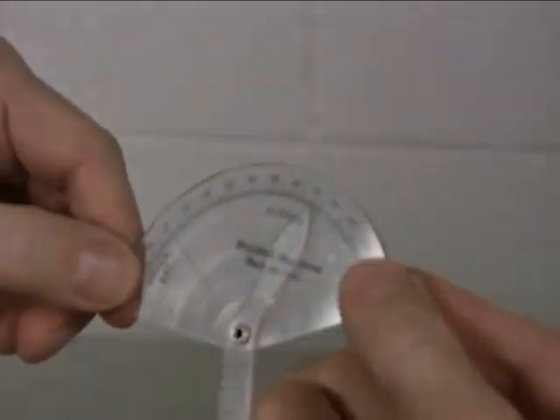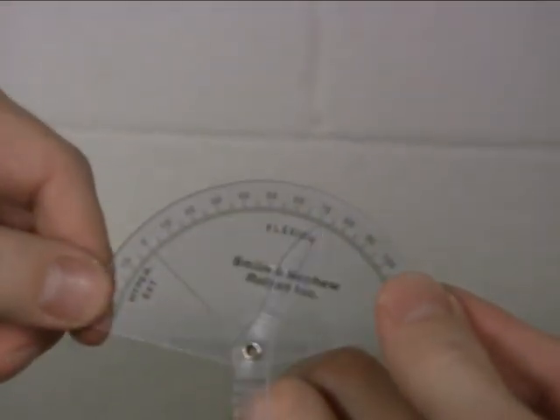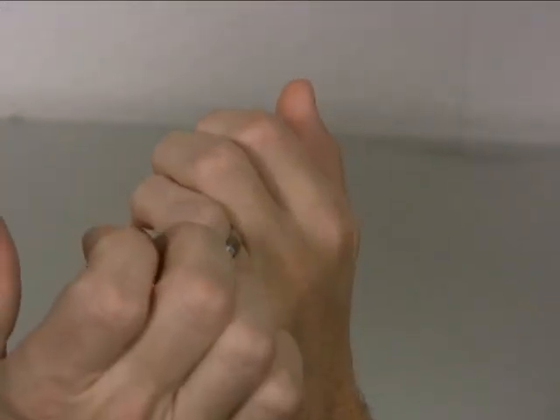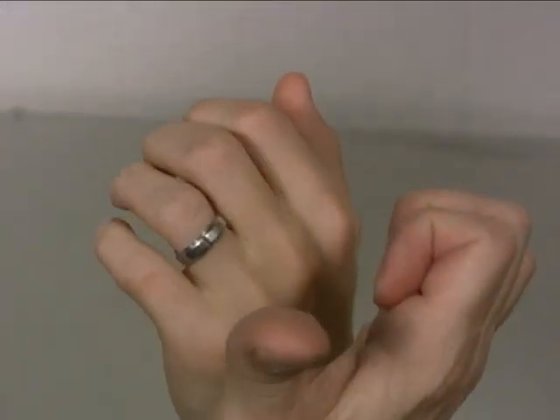And have about 73 degrees of flexion at the DIP joint. Again, according to the American Medical Association, the DIP joint flexion is measured in a hook fist like this.